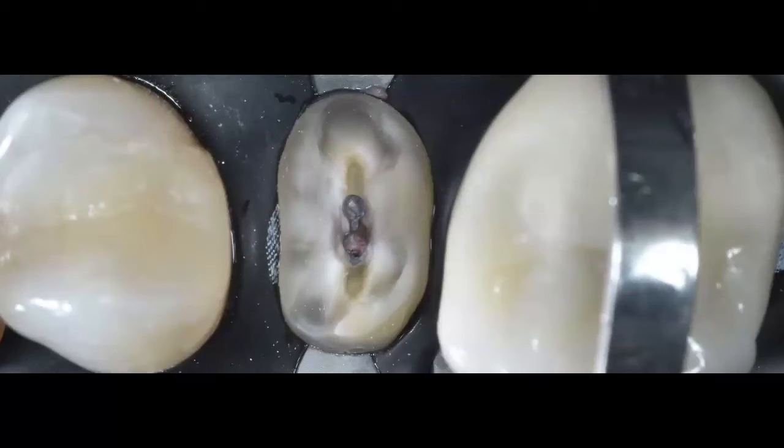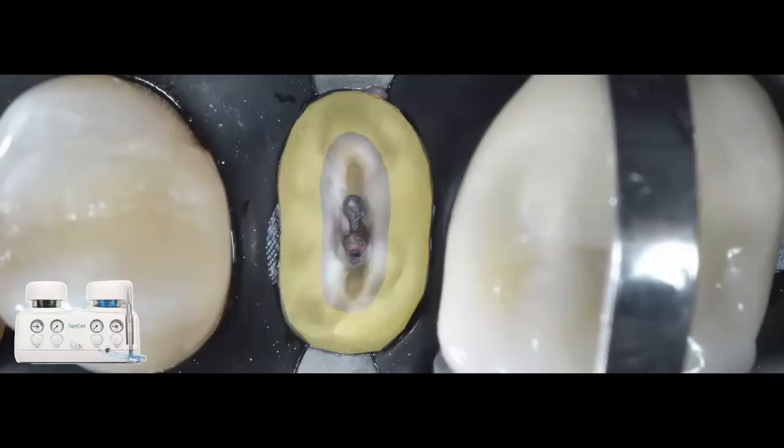Once I get to that point, and because we're not going to use any phosphoric acid to etch this dentin, I'm going to use my Aquacare in this step just to remove that smear layer. This is definitely going to increase my bond strength. Again, I'm going to mark it right here. There is the Aquacare. I've cleaned with the Aquacare. You can see how nice and clean that surface is now. And now I have what we call the peripheral seal zone, where I'm going to get my greatest bond strength.